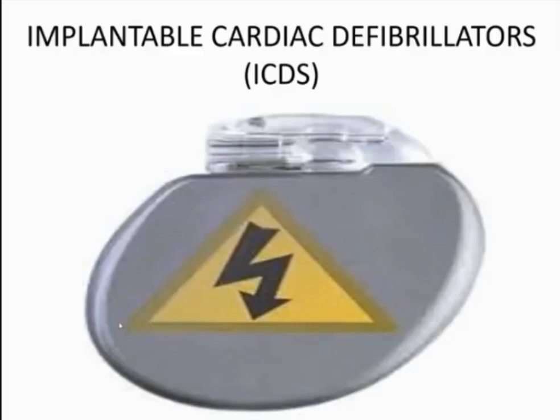This is an implantable cardiac defibrillator. هذا هم يعتبر pacing، يشتغل كpacemaker، بس إلى فائدة أخرى، اللي هو يكون الجهاز أكبر طبعاً وأضخم من البيس ميكر، بيس ميكر يكون أصغر. هذا نستخدمه في المريض اللي عنده فيتال ارثميز، لايك في تي اور في اف، وممكن المريض يصير عنده fatal arrhythmias like VF and VT because he has abnormal heart function, he has cardiomyopathy or heart failure or previous myocardial infarction, is at risk of developing VT and VF.